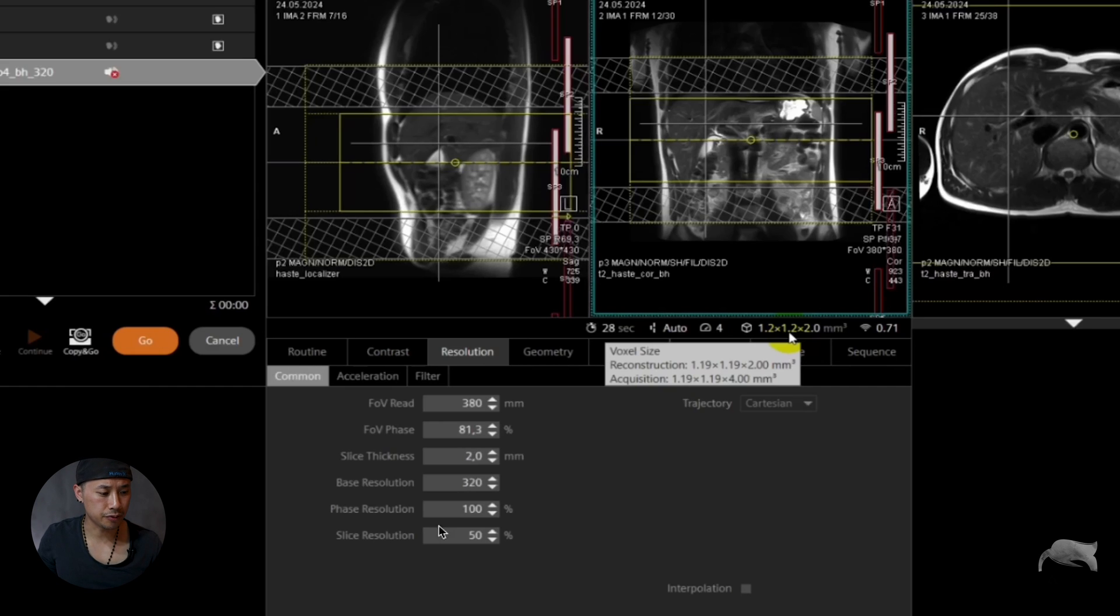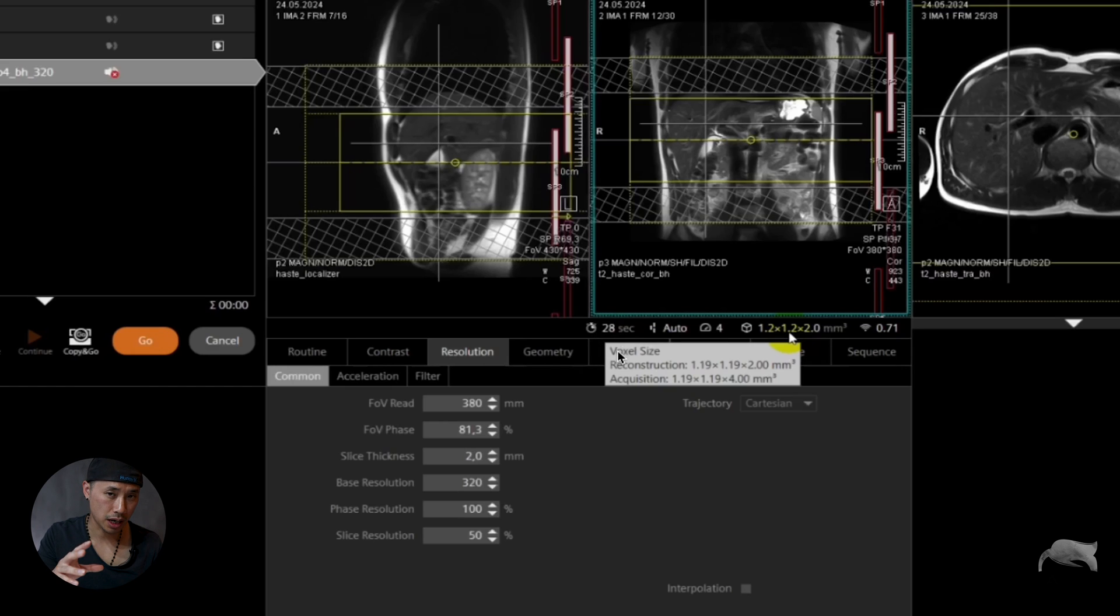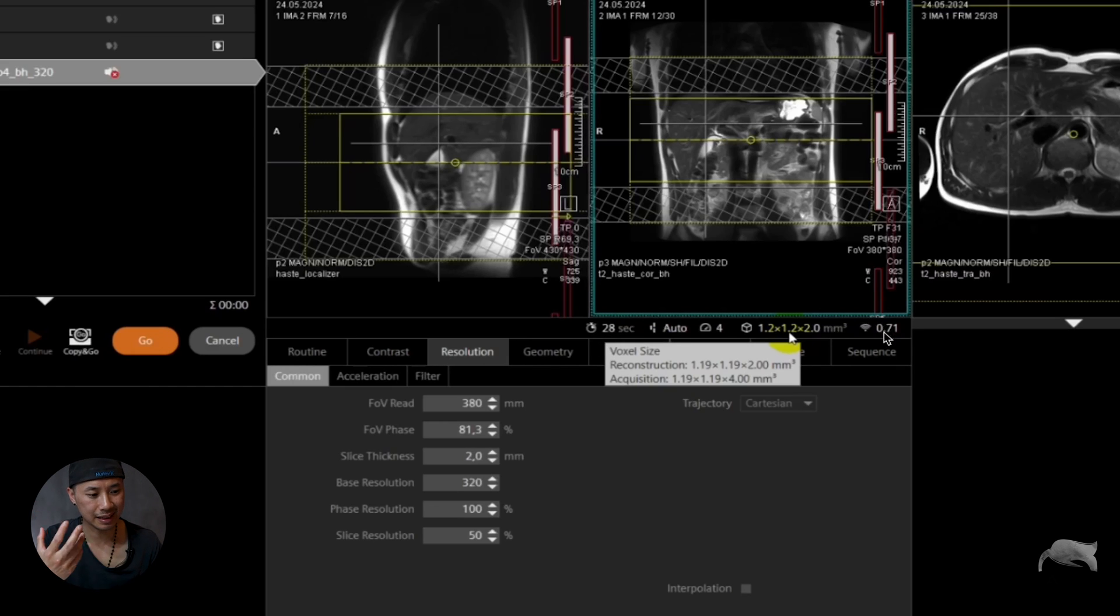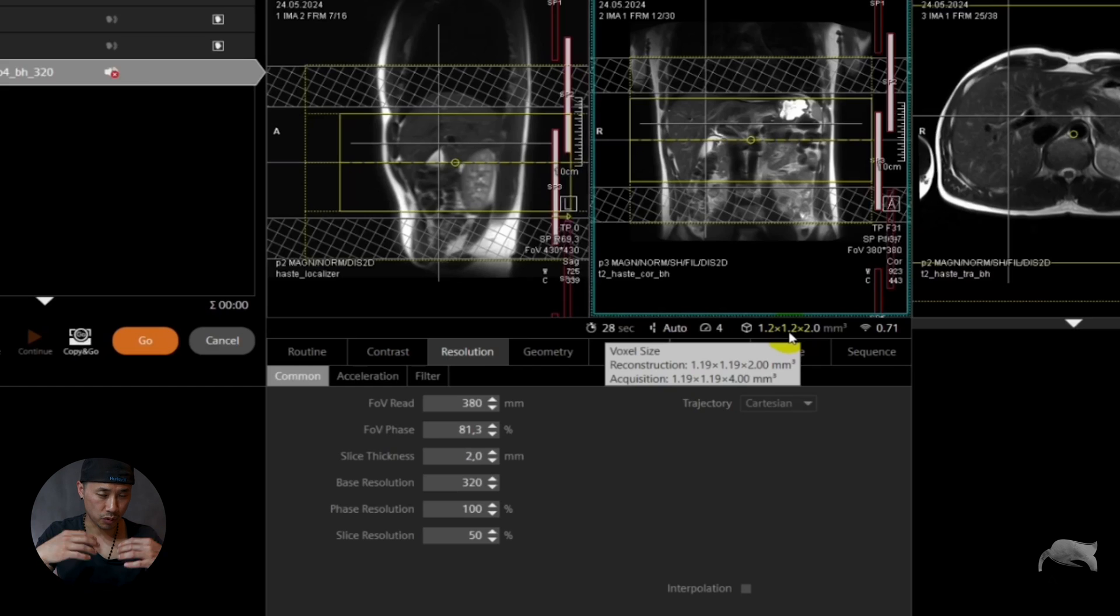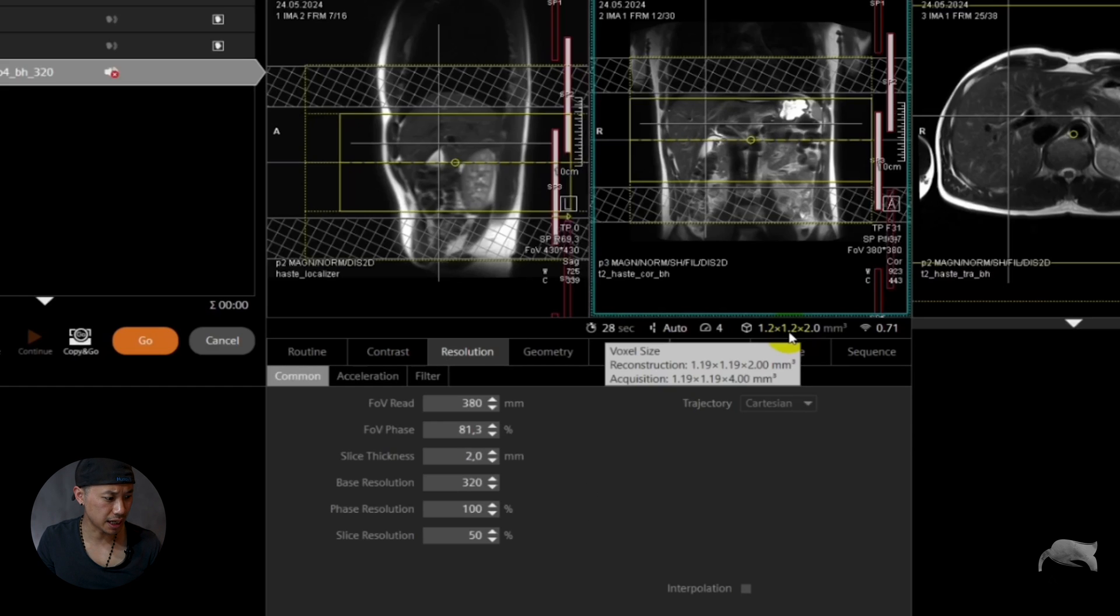And then the scan time, it's still too high. We went from 36, now we are 28. We gain a little bit more SNR. The reason for SNR is that the voxel sizes are a little bit bigger so you get more SNR, right? But we can also see that we need more slices.